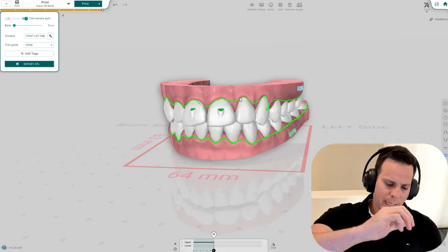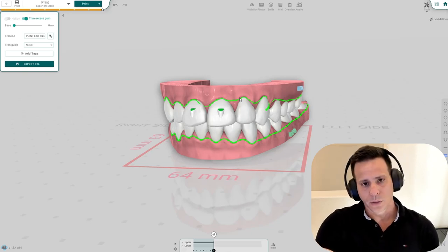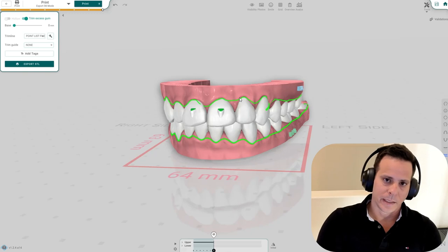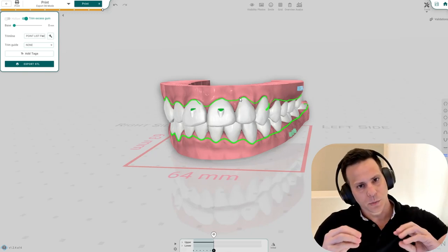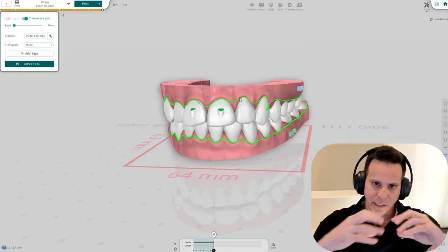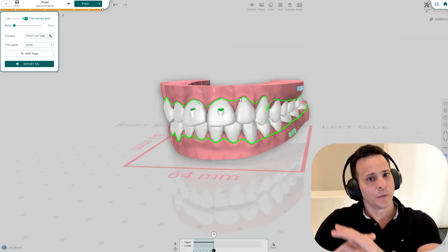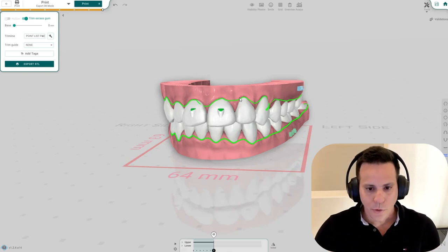So as soon as we return from AAO, these are the two things that we're going to release: our hollow model support and our advanced waxing, for the undercuts, interproximal, the smoothness and the blending between it. There's going to be a lot of things that even if you don't use direct printing, are going to benefit you. So I hope you like it.